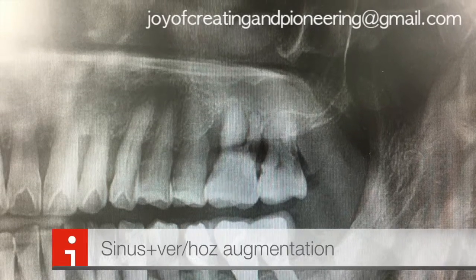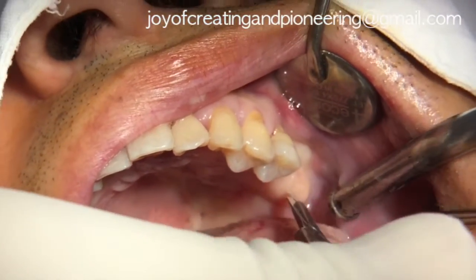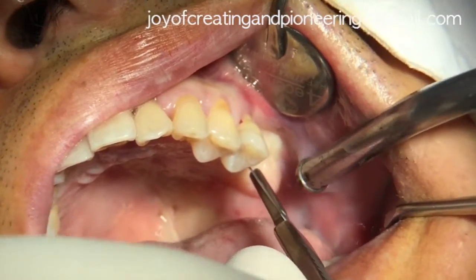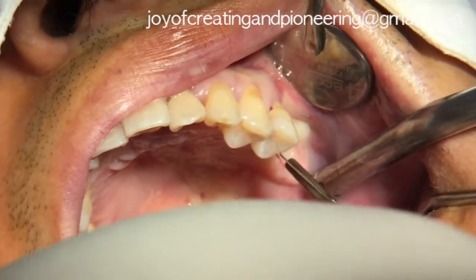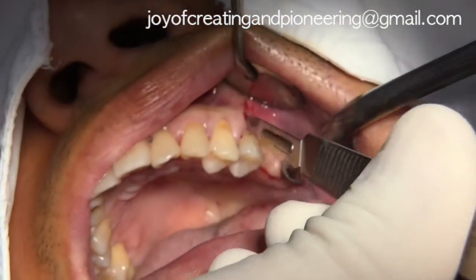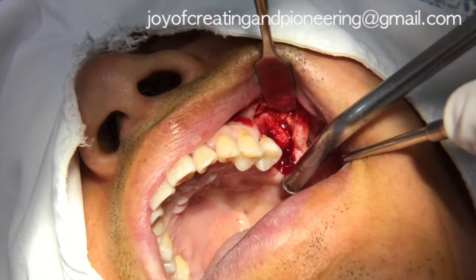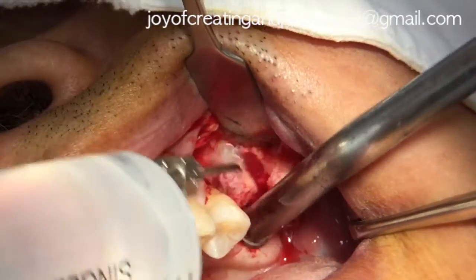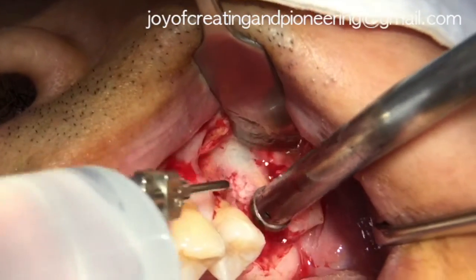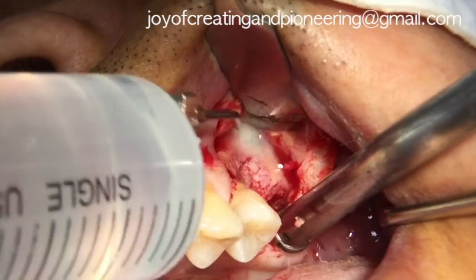Sinus graft was performed with vertical and horizontal GBR. A slightly lingualized incision and cut back incision at 120 degrees on the distal side was placed. Also, a vertical incision with hockey stick shape was placed at the medial side of the adjacent teeth. After the flap reflection, copious irrigation was performed and the grey area reveals the position of the lateral wall of the sinus.